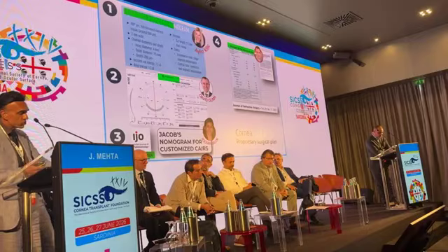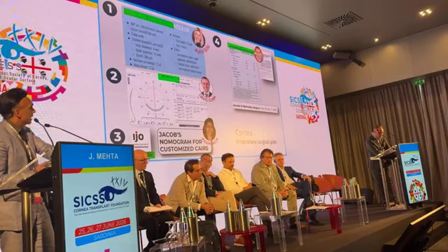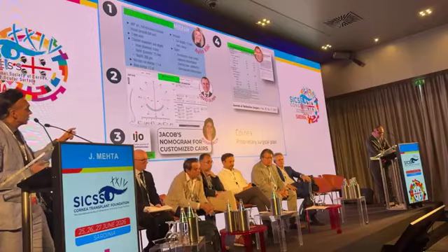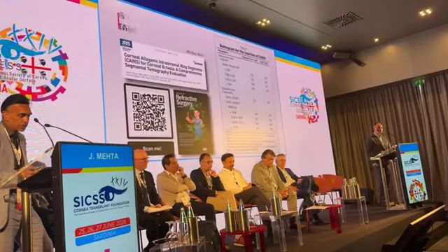If you're going to use fresh tissue, I would use Susan's nomogram. If you're going to use Cariclear, I would use Eileen's nomogram. So it really depends on what tissue you're going to use, because it's going to affect the size of your tunnel when you're putting that segment in as well. The last bit, I'm going to show you just a few results from over here.